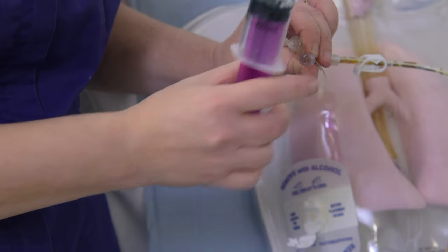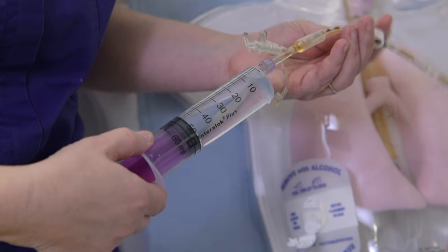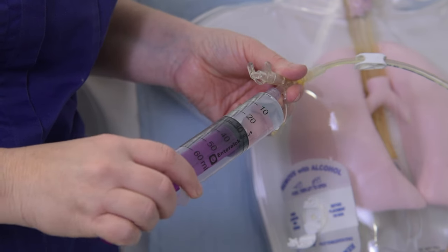If another medication is needed, flush the tube with the recommended amount of cool, boiled water and repeat the process of giving the medication. Once all medications are given, a water flush should be given as recommended by your dietitian.